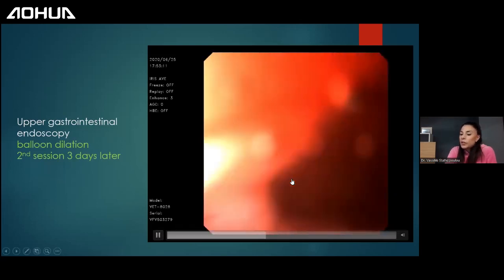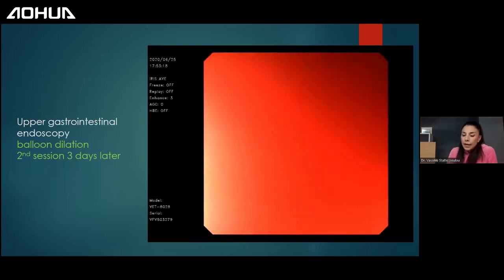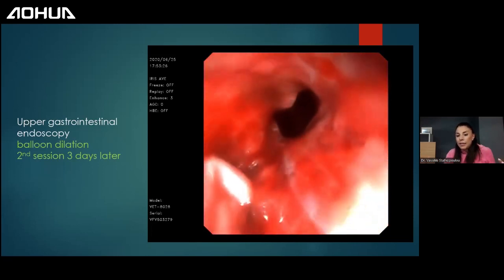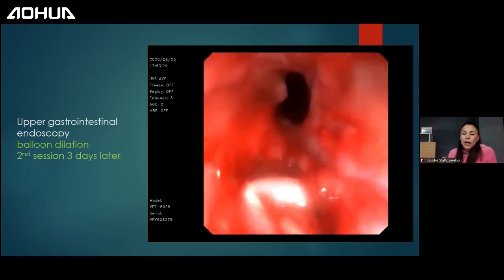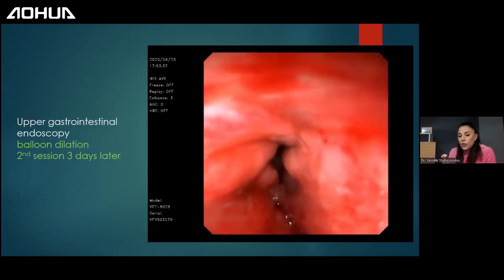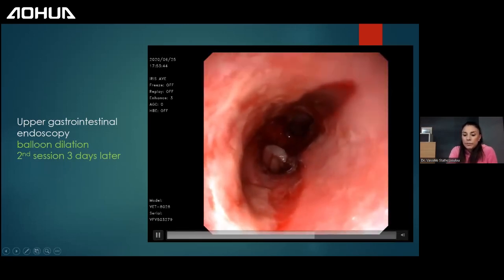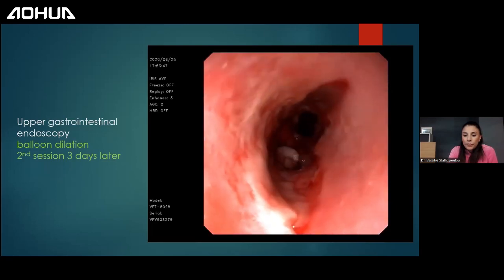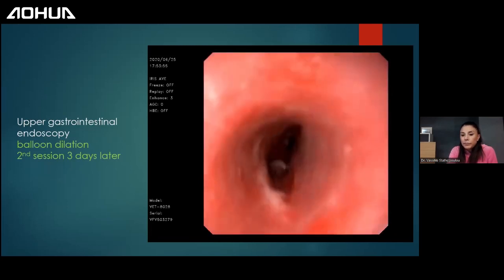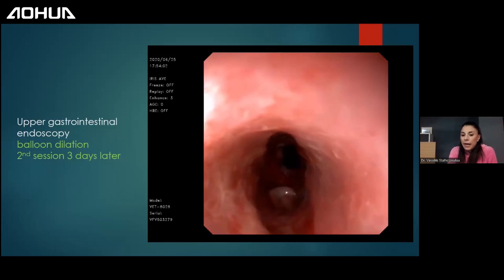Do I remove this tissue here? No, I don't. I do not remove this tissue with a forceps. I just leave it like that. And again, what you can do is some triamcinolone, but of course, this is a very, very lengthy stricture. So most of the times we do triamcinolone in quadrants when we have a stricture that's shorter. Okay, but of course you can do here circumferentially triamcinolone injections if you want. But this is a big tearing of the esophagus. And now it has a diameter that the cat can definitely eat and pass the food.